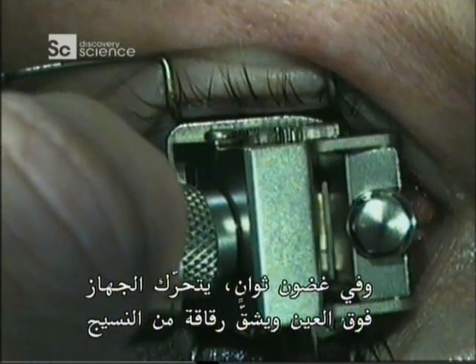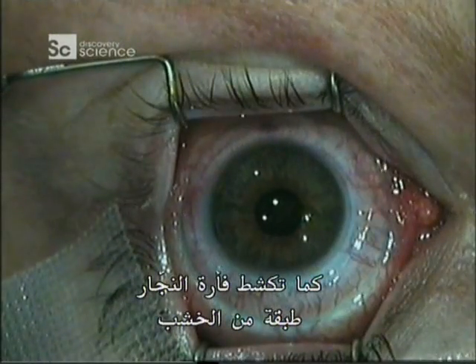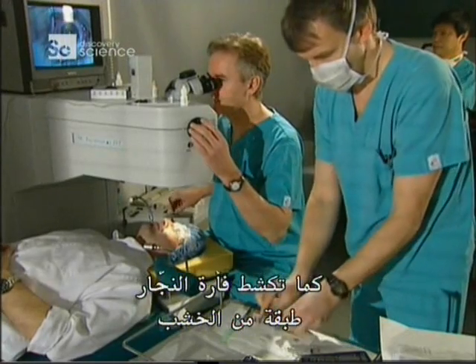In a matter of seconds, the device moves across the eye, cutting open a flap of tissue — the same way a carpenter's plane shaves a layer of wood.